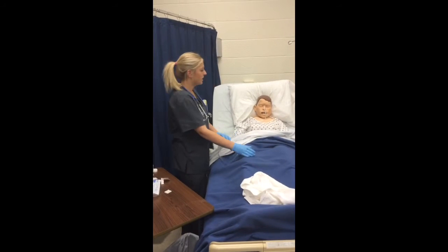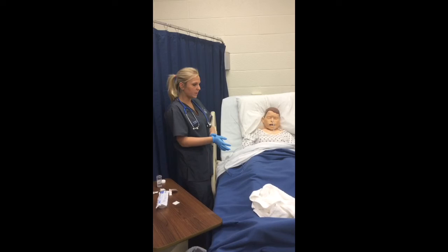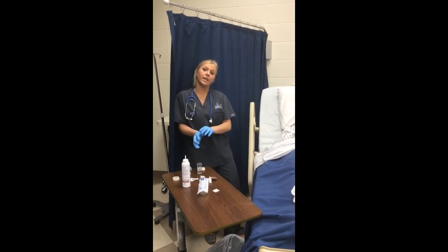We are going to document that it was placed, how the patient tolerated it, and the 2 ways that we checked to make sure it was placed. Take off my gloves and wash my hands.